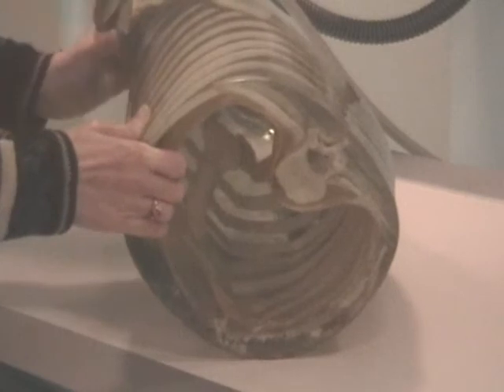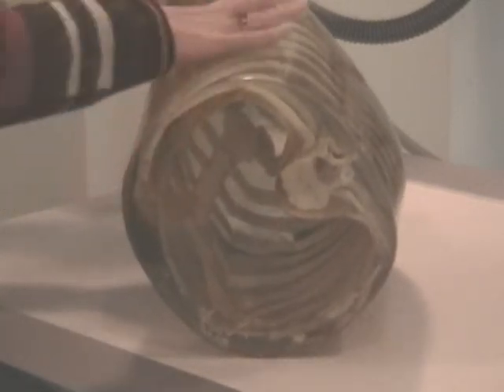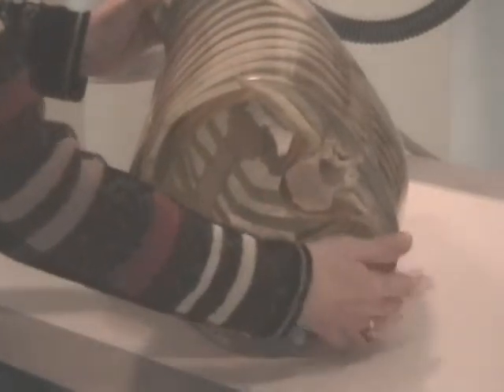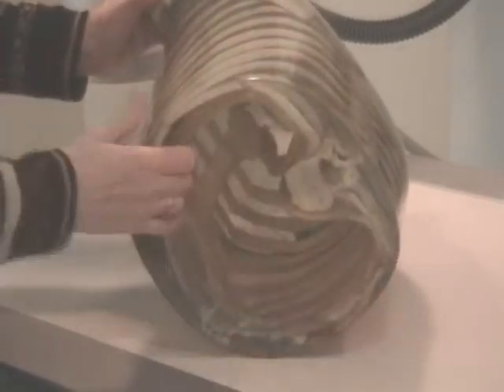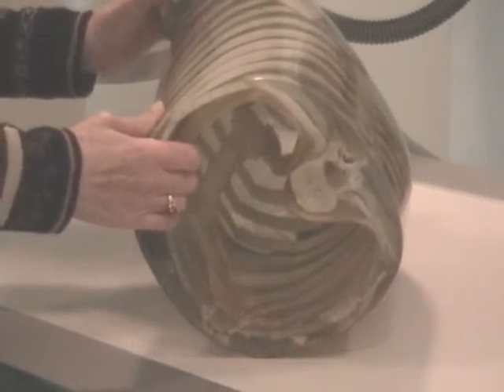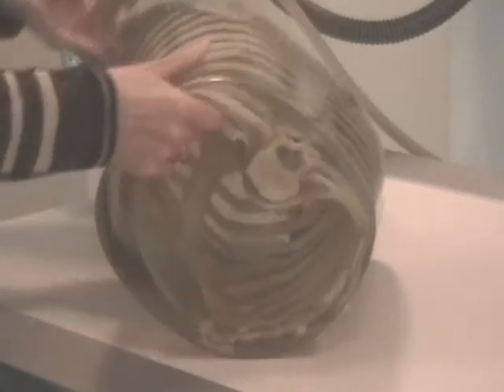What ribs have we laid out, and what ribs are going to be underneath the spine? See how we've taken these lateral ribs now and laid them out, and the spine is now over this side. This side will be twice as wide as this side. Okay? So if you're doing a rib exam for anterior injuries, you oblique the patient affected side away. Let's go to the vertical board and demonstrate this.